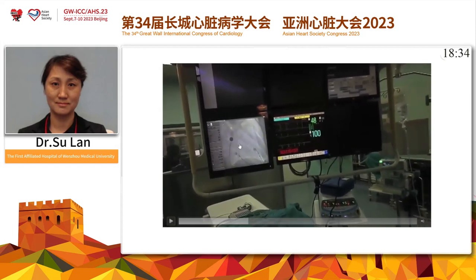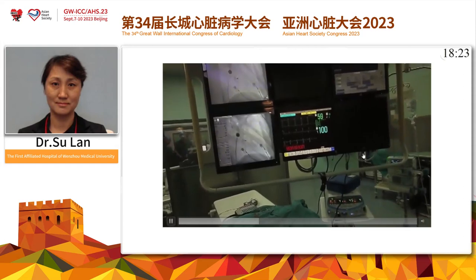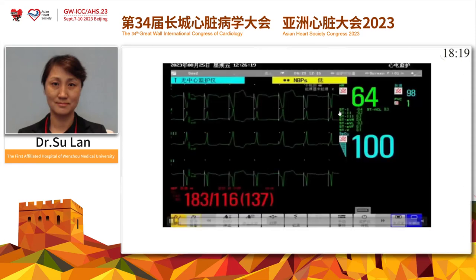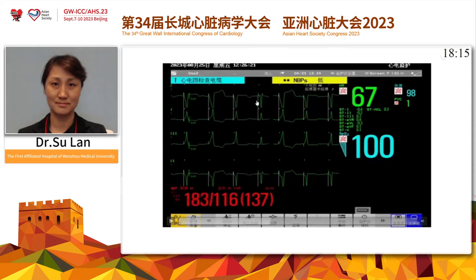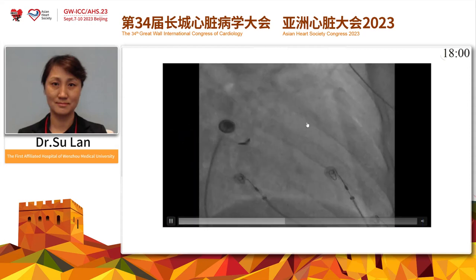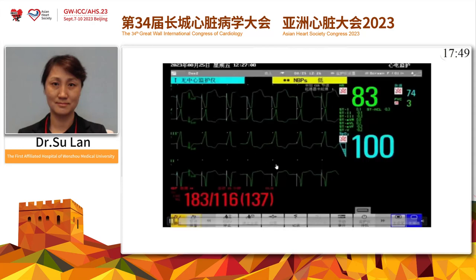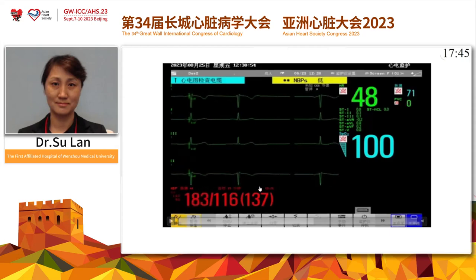First of all, I was mapping the HBE boundary area. The pacing mapping is performed under X-ray imaging. After finding the HBE boundary and confirming capture, we can observe this in the display — this is not captured and this is captured at the HBE boundary. I kept the X-ray imaging as a mask. The PSA also showed obvious His bundle potential after a big atrial wave, and the His threshold was about 3 volts for the preliminary test.